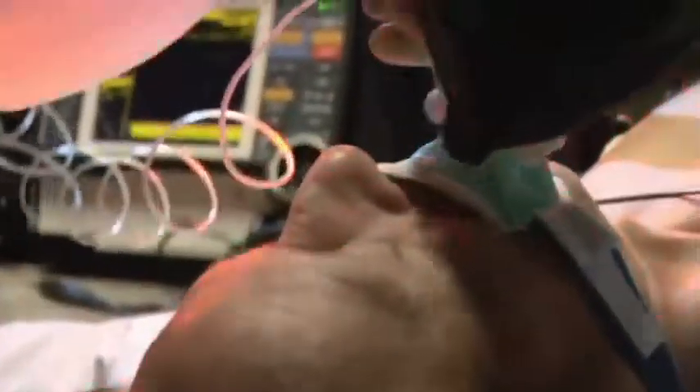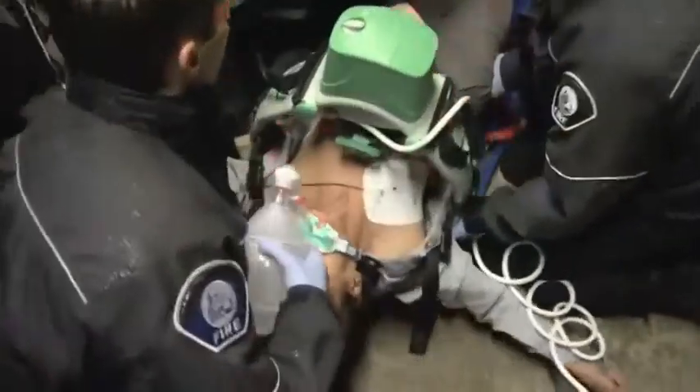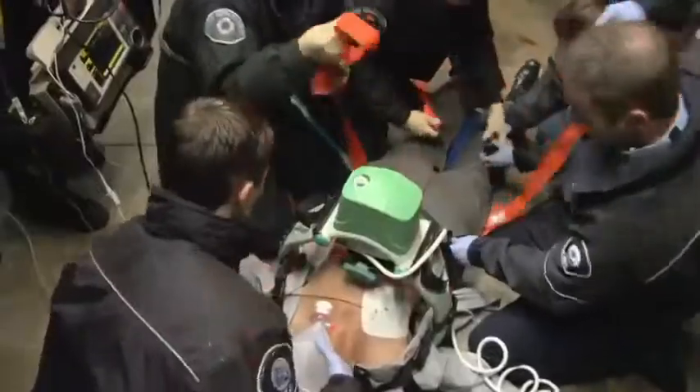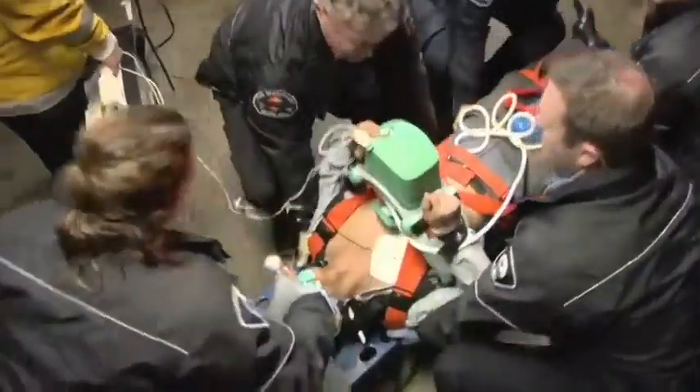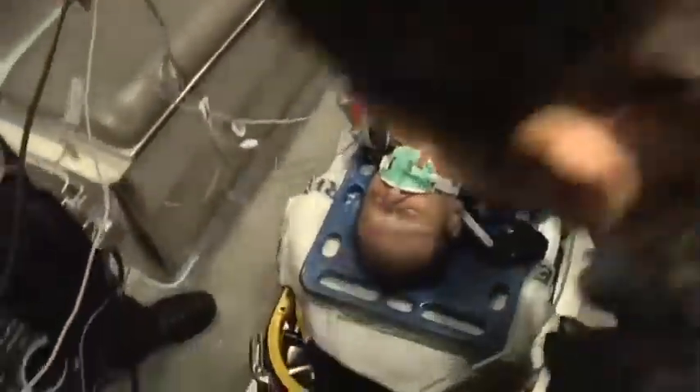It can be used by ALS and BLS responders out of hospital, and by code teams, cath labs, and emergency departments in hospital. Use it to treat patients following the same protocols as for manual CPR. Lucas allows for effective compressions during patient transport and safety for both the patient and personnel.